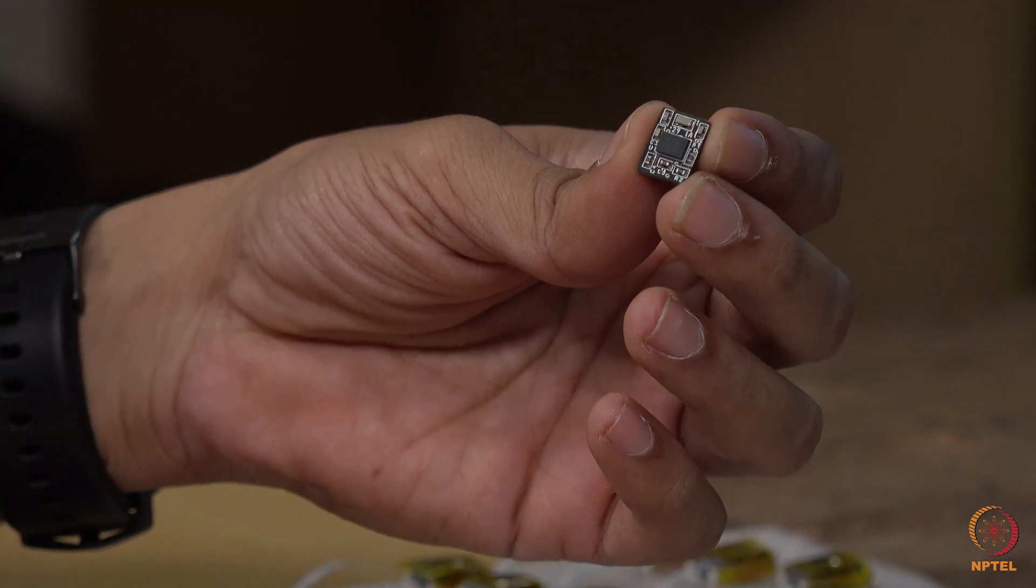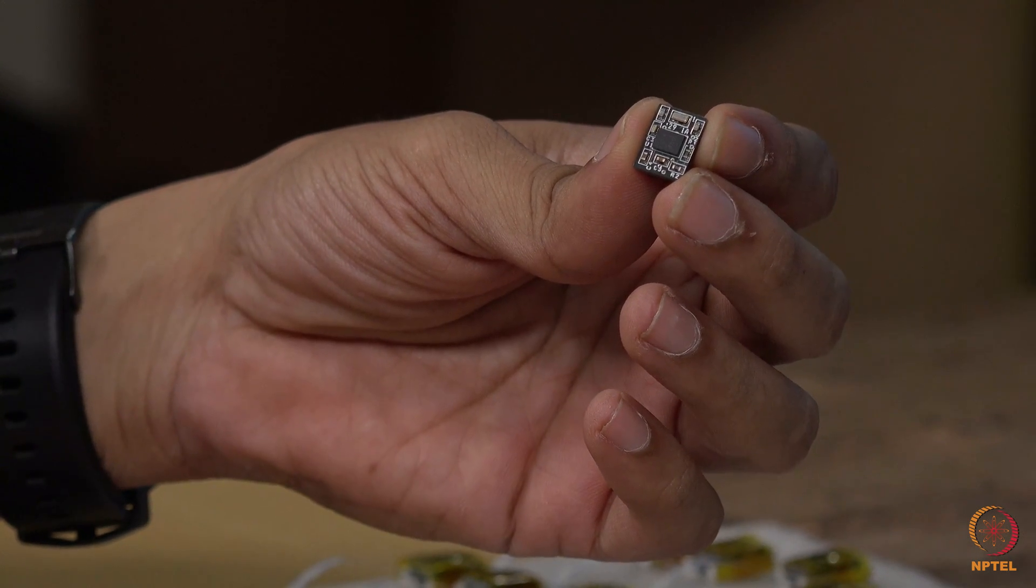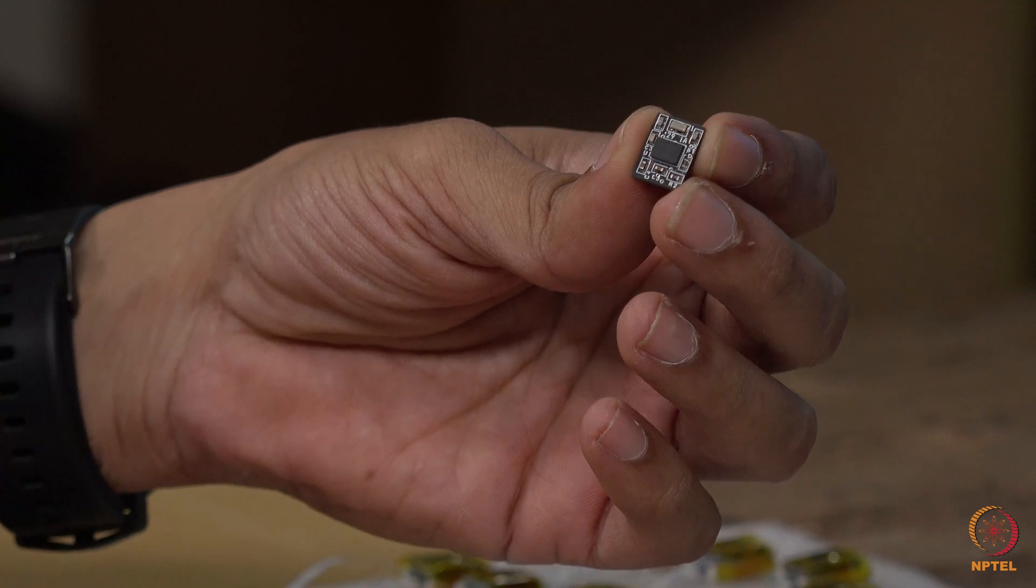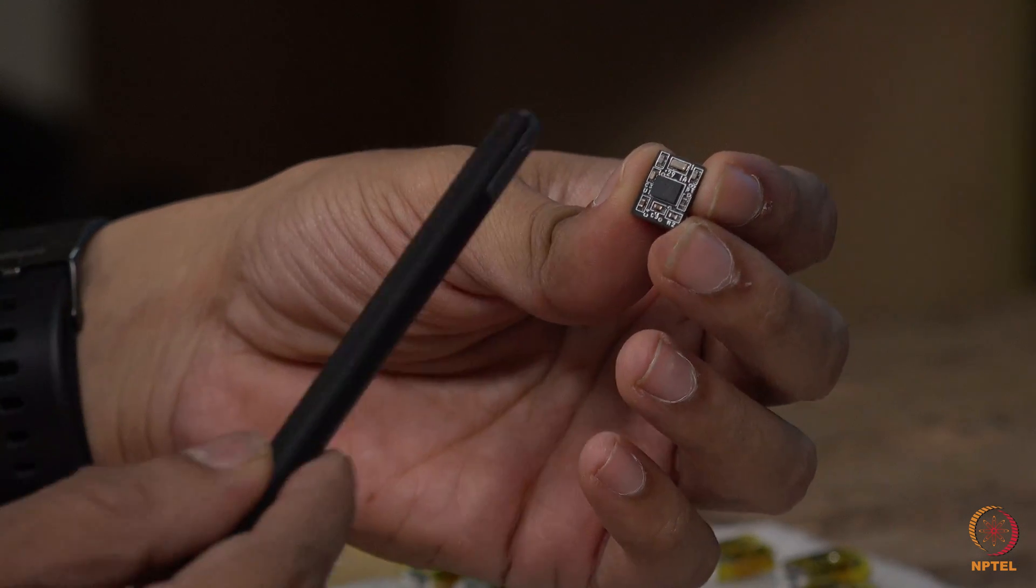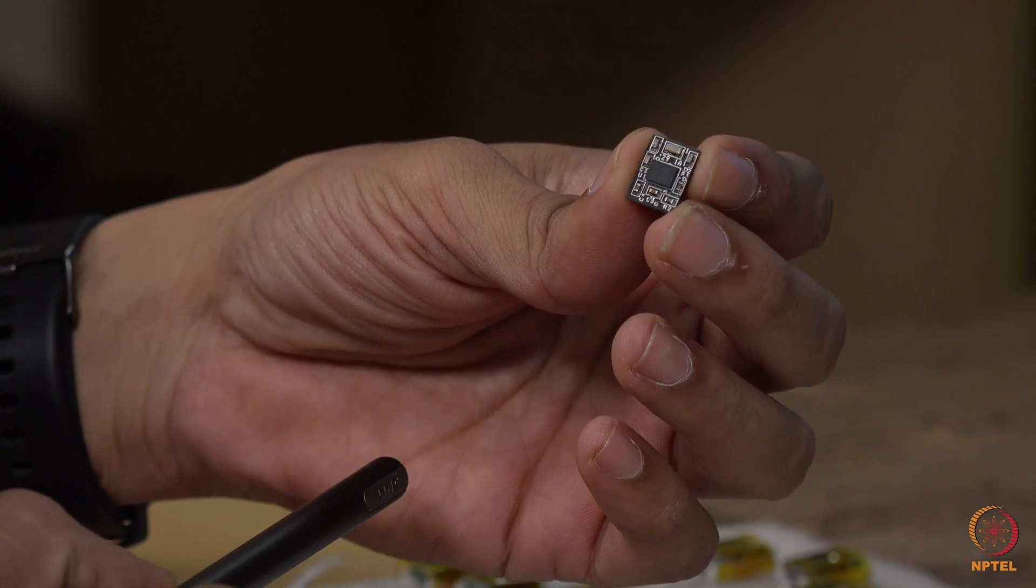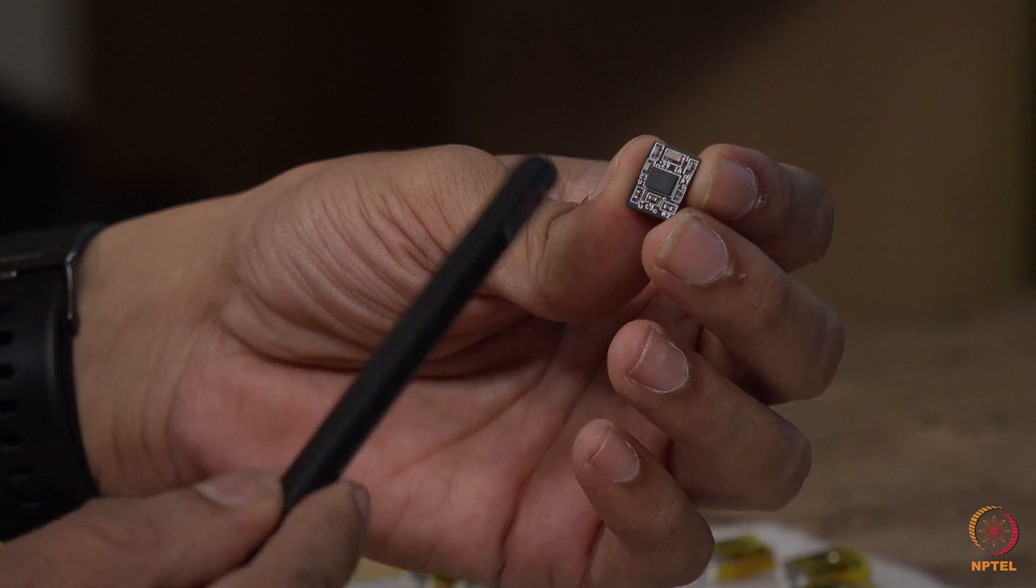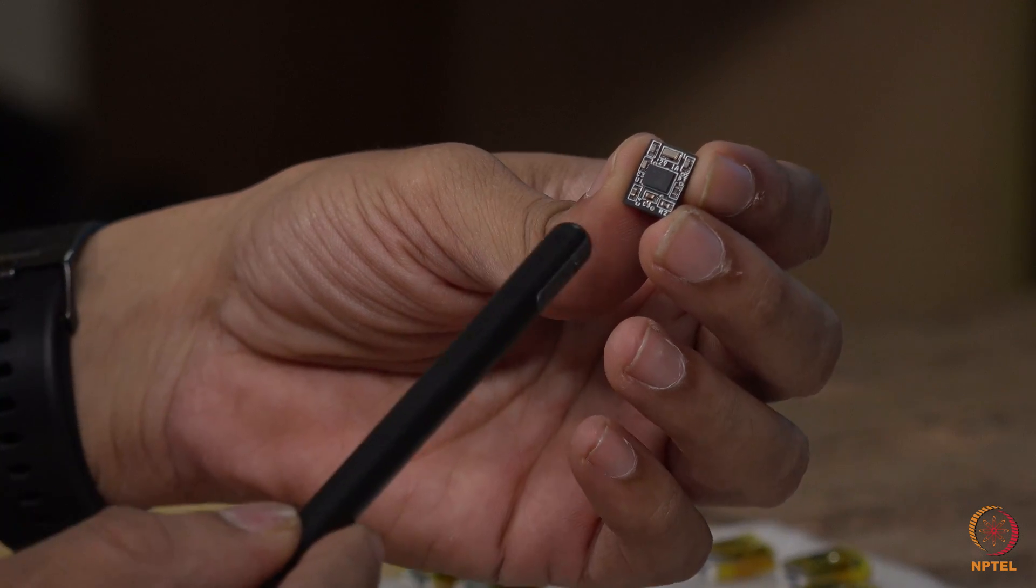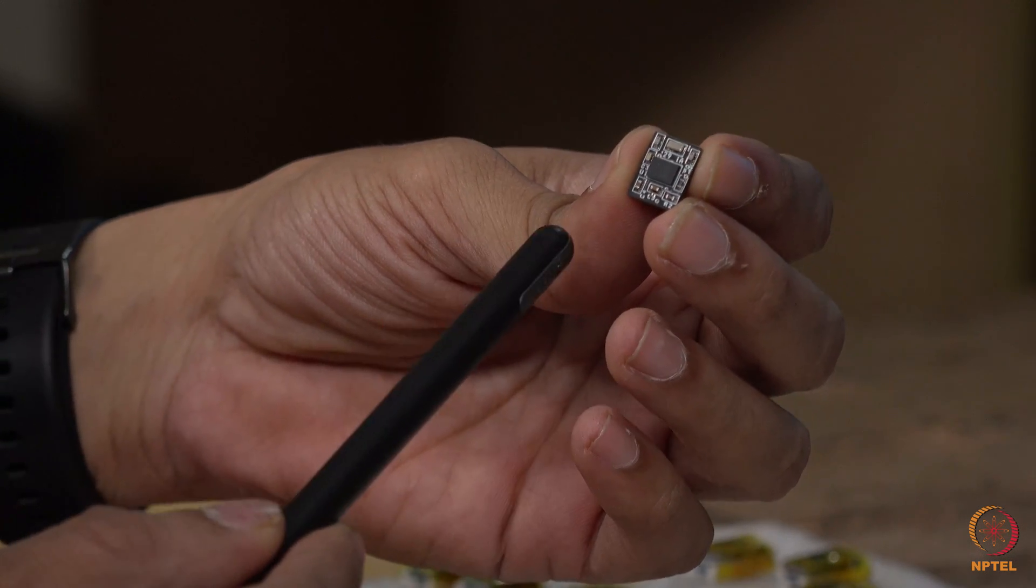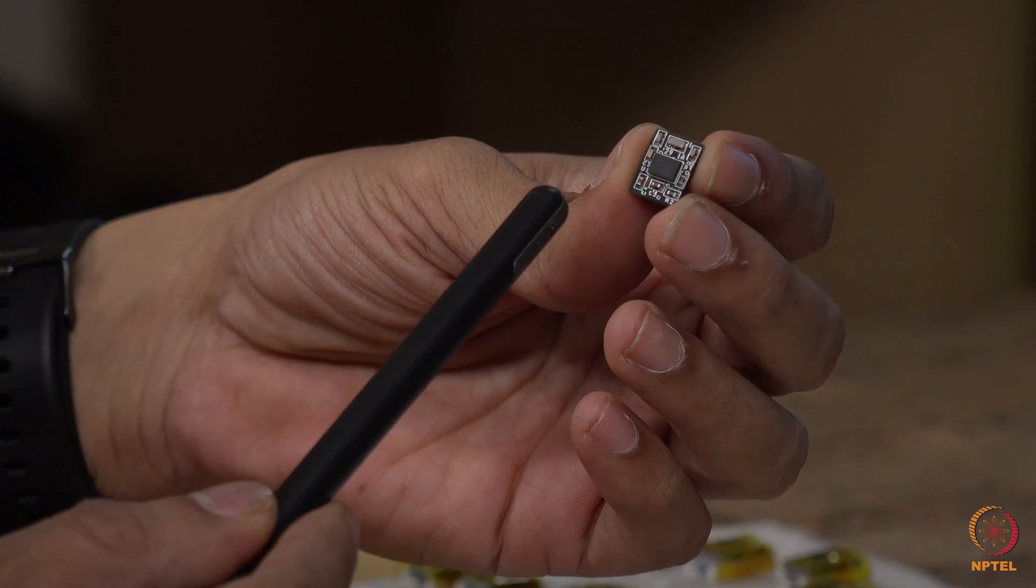This is the printed circuit board which consists of the main chip BNO055 and all other components that are required for the operation of this device. This is made to be as sleek as possible for the size of 1 centimeter by 1.3 centimeter.